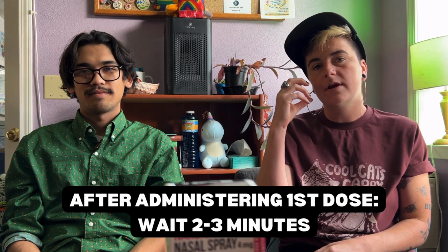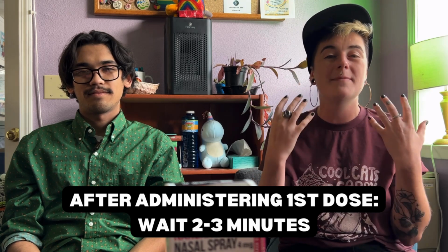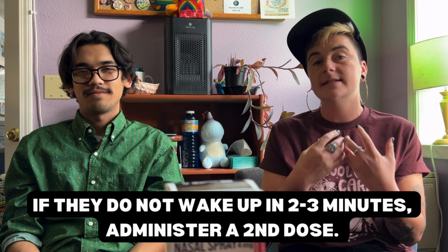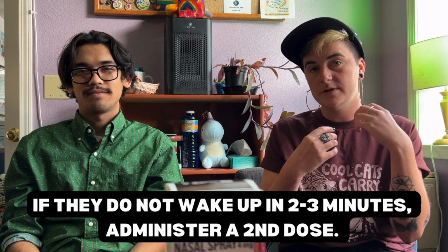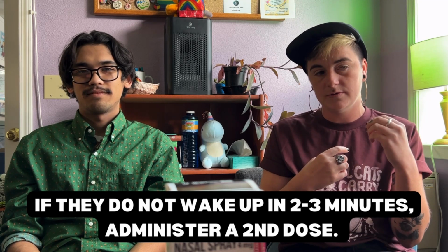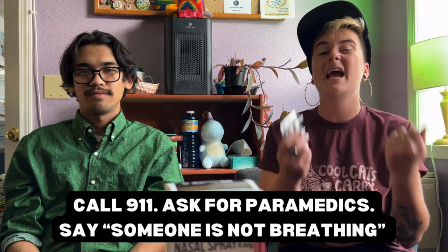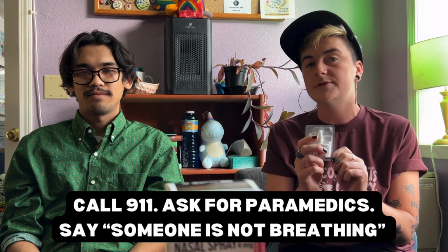Once you administer Narcan for that first dose, you're going to wait about 2 to 3 minutes to see if they wake up. If that person doesn't wake up in that 2-minute window, you're going to want to give them another dose. In that 2-minute window, it's also a good time to call 911 and get paramedics on their way with more doses of Narcan.